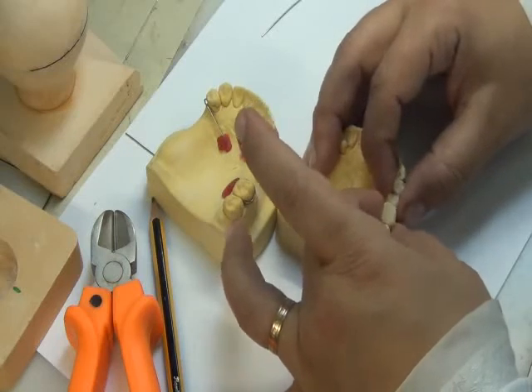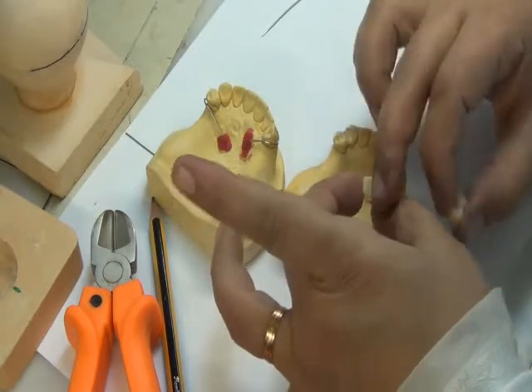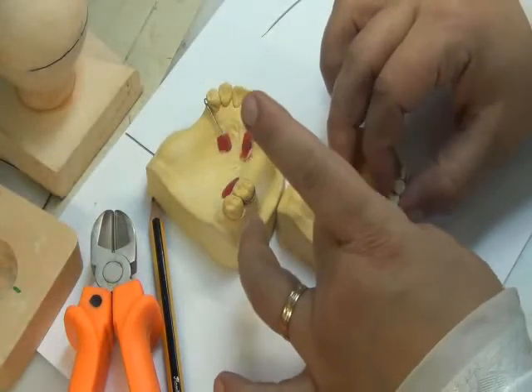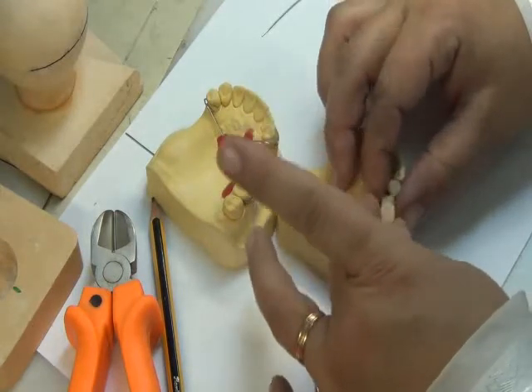If 1 millimeter is missing, I could simply trim slightly, very slightly, from the mesial and distal of all teeth, and fit them in. Within 1 millimeter, 2 millimeters, I could distribute the reduction amongst the teeth themselves.